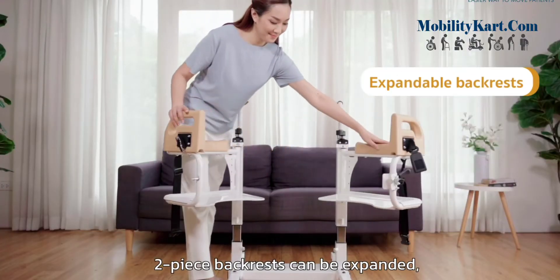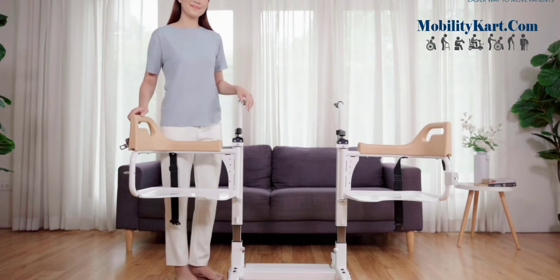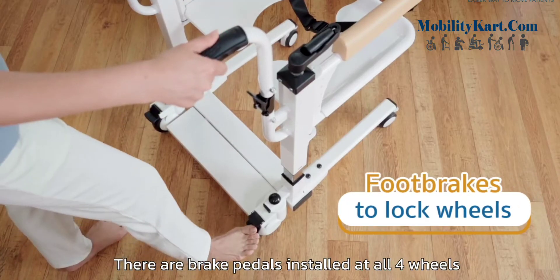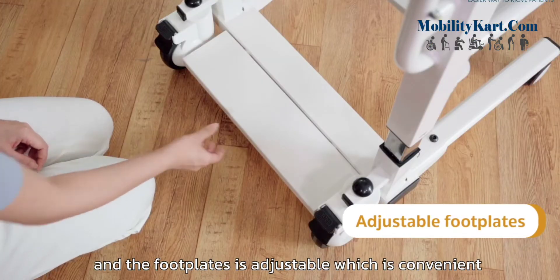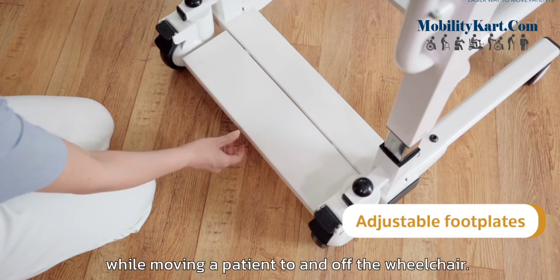Two-piece backrests can be expanded, and there is a double lock for safety. There are brake pedals installed at all four wheels to prevent slipping while using the wheelchair. The foot plates are adjustable, which is convenient while moving a patient to and off the wheelchair.